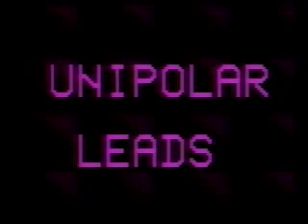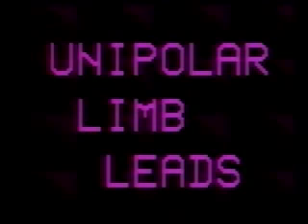All other leads are unipolar leads. The letter V stands for a unipolar lead. So AVR, AVL and AVF are unipolar limb leads, and V1, V2, V3, V4, V5 and V6 are unipolar chest leads.